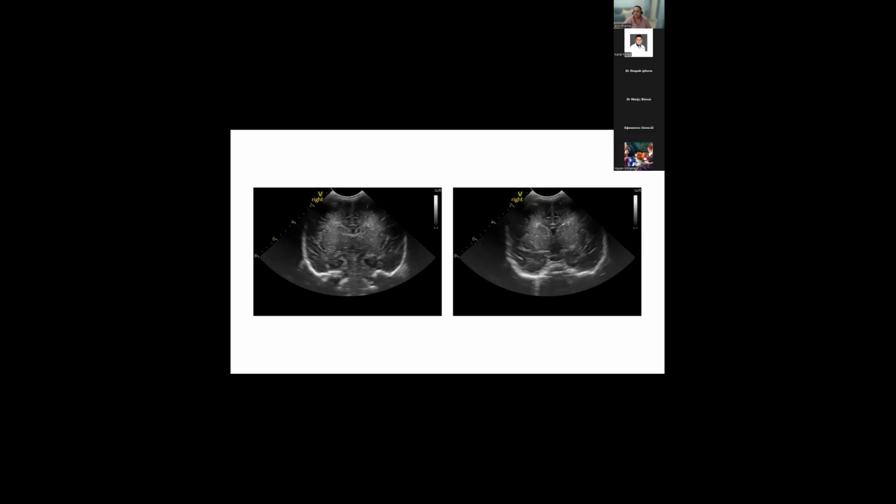Also in the midline, interhemispheric fissure, yep, then corpus callosum, yep, cavum septum pellucidum, yeah, and the third ventricle, yeah, and after the third ventricle the aqueductus, yep. So the third ventricle is visible, and it's a little bit better visible over here in that these ventricles are very small. They disappear a little bit, but getting that view where normally the lateral ventricles would communicate with the third ventricle is not easy because this brain is now quite mature.